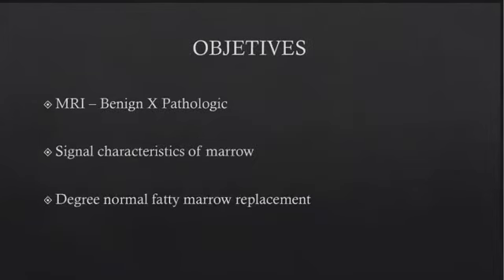The objectives of this study are to assess the capabilities of MRI in distinguishing benign from pathological compression fractures of vertebral bodies, to describe the signal characteristics of marrow in benign post-traumatic compression of varying age, and to evaluate the degree of normal marrow replacement in benign and pathological fractures with a pre-saturation technique.